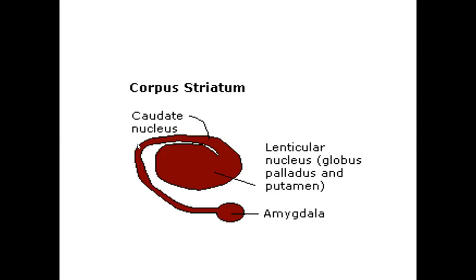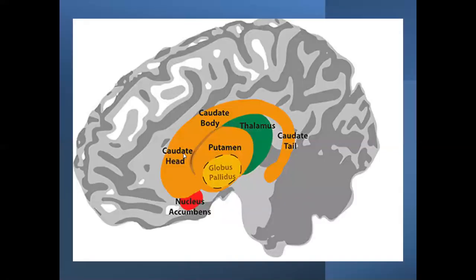Here you can see the caudate nucleus and the lentiform nucleus. The caudate nucleus has a head, body, and tail. The putamen and globus pallidus together form the lentiform nucleus, and this is the thalamus.